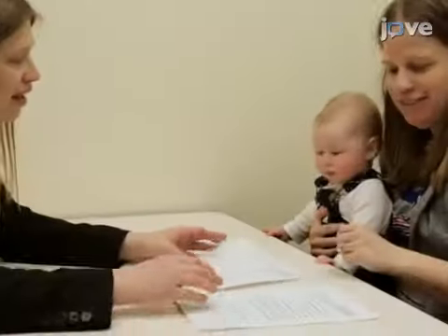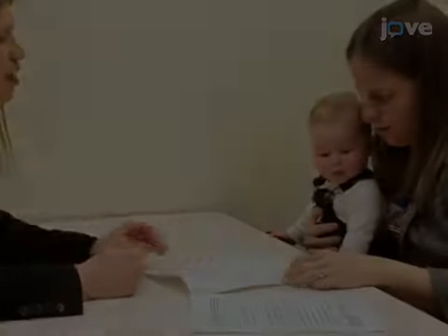Obtain informed parental consent and explain the EEG experiment.